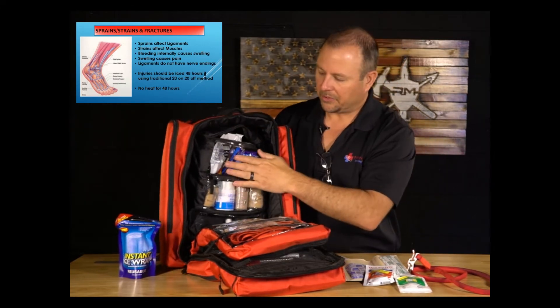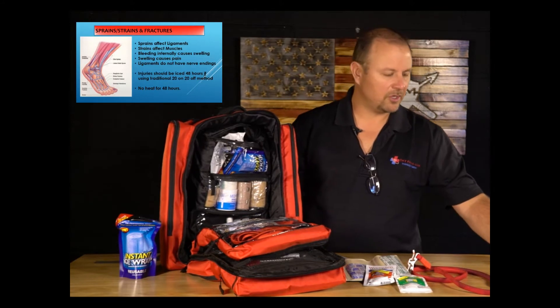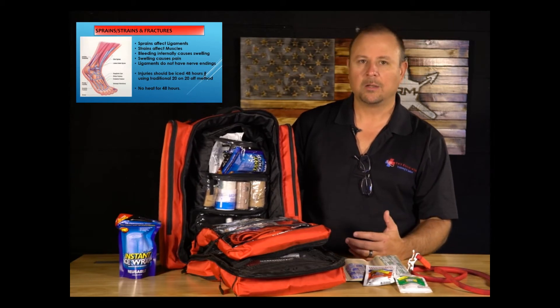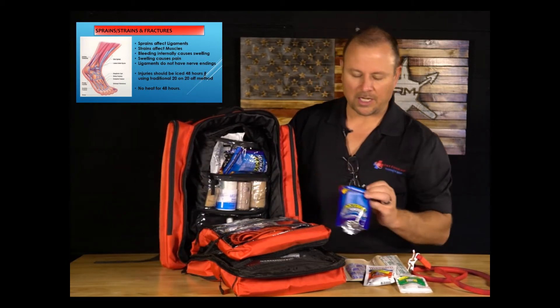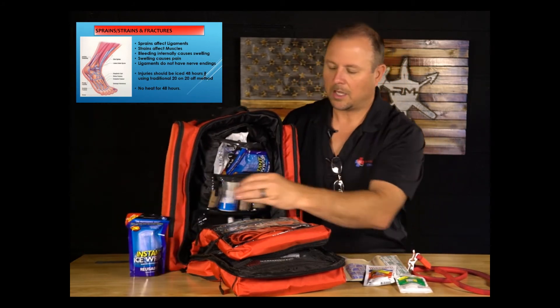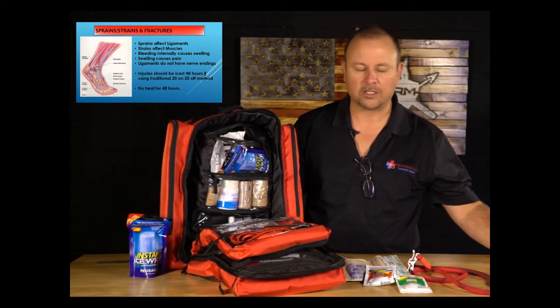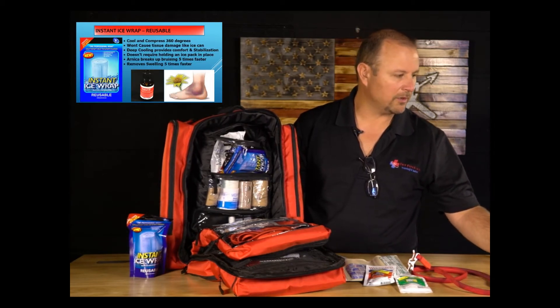The instant ice wrap is the long-term solution for sprains and strains. Ice is unnatural to the body — when you ice, the body pulls more blood to the area to warm it back up. The instant ice wrap uses evaporative cooling instead of direct cooling, so the body doesn't fight it. These are a favorite item for any sprain, strain, closed fracture, or situation with bruising and swelling in an extremity.